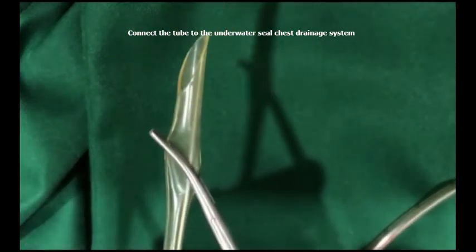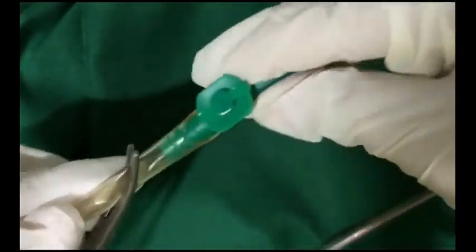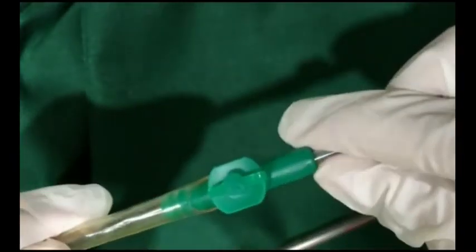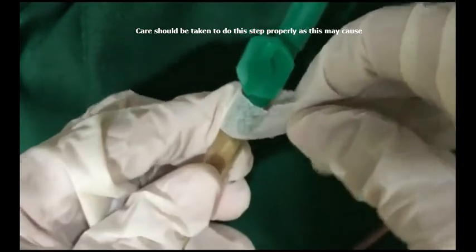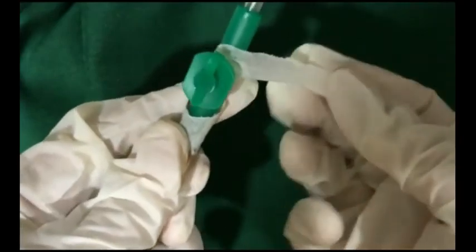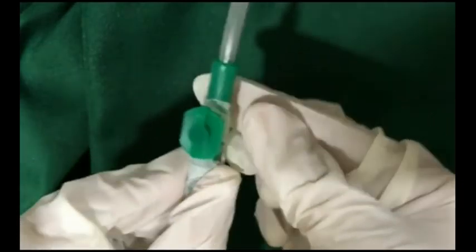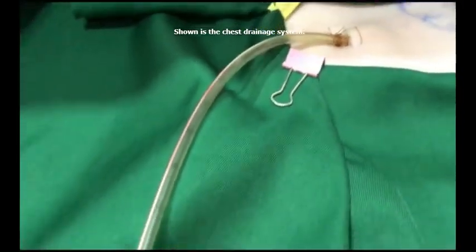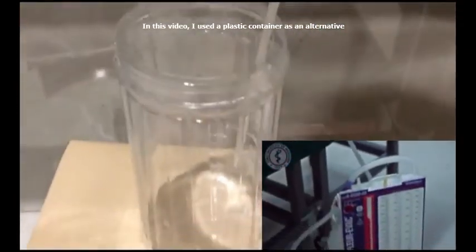Connect the tube to the underwater seal chest drainage system. Care should be taken to do this step properly, as this may cause pneumothorax if tube is disconnected from the underwater seal. Shown is the chest drainage system. In this video, I used a plastic container as an alternative.